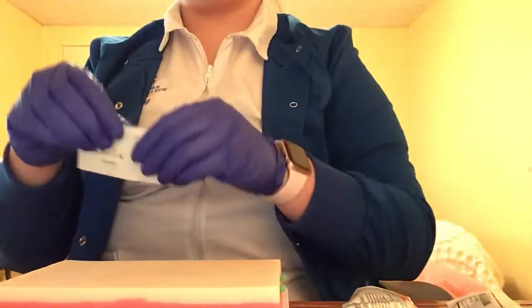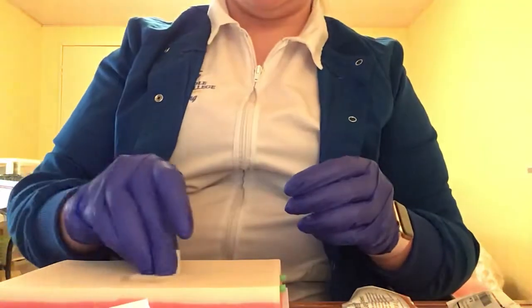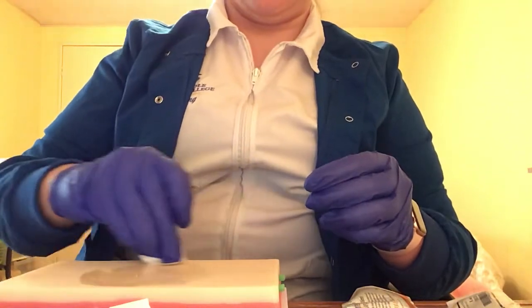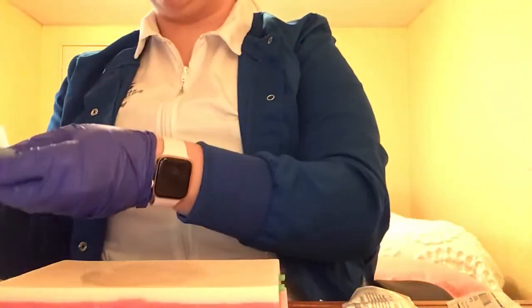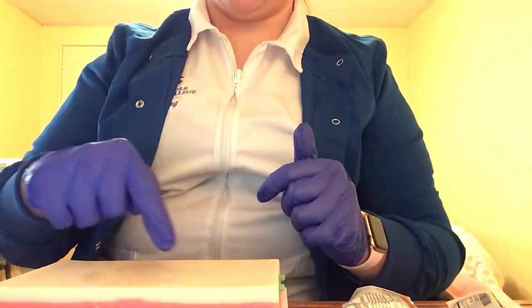So we're going to pretend my skin here is Anna's arm. I'm going to see if I can bring it down just a little bit more. Okay, so now I'm going to take an alcohol pad and I'm going to clean from the inside to the out of the skin. I'm going to let that air dry for a few seconds. And we're pretending that this is her deltoid, so I'm going to give it right in this triangle right here.